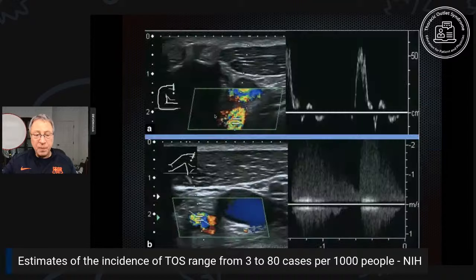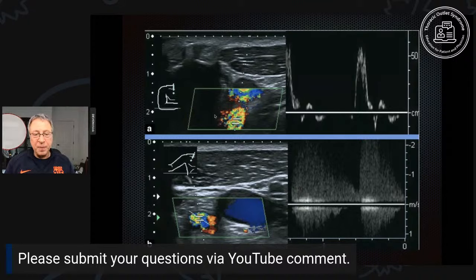It's very useful. So there's two pictures here, one at the top above the purple line and one at the bottom. And they both measure the same thing. They're measuring the axillary artery, which occurs right after the subclavian artery. It's between the rib and the clavicle. That's the subclavian artery. And then the axillary artery occurs. On the top, you'll see the top picture to the right, there's a little waveform. Looks like a sonar that you see in war movies when they're showing a submarine using its sonar. The bottom picture, below the purple line, you'll see to the right, these big gray triangular shapes.